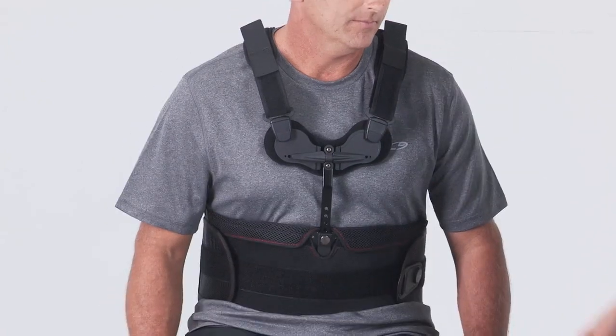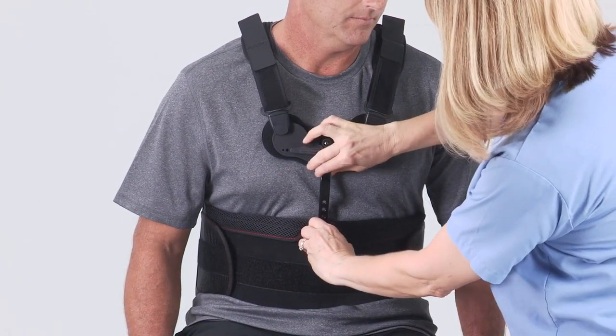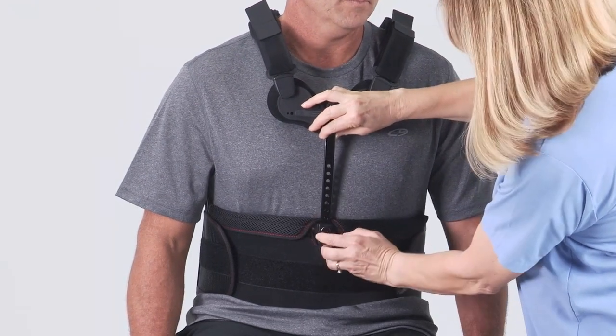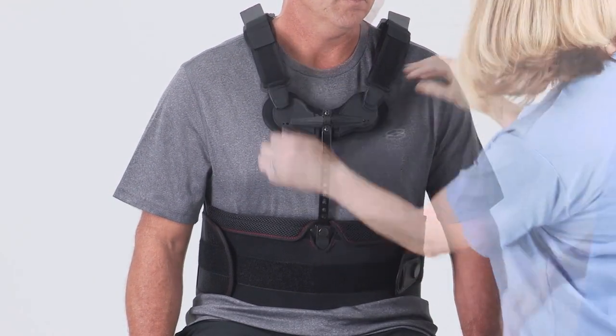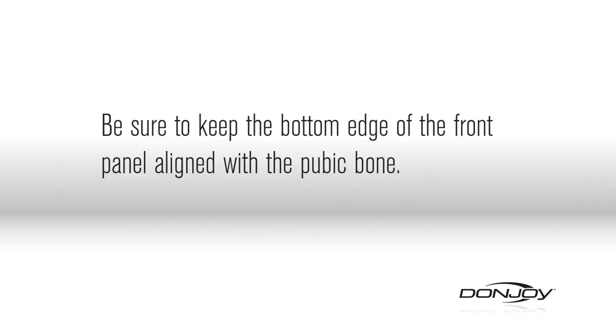Adjust the sternal Y bar by pulling up on the release button to release the sternal bar lock. Slide the sternal Y bar into position so that the top of the sternal pad fits half an inch below the sternal notch. Be sure to keep the bottom edge of the front panel aligned with the pubic bone.